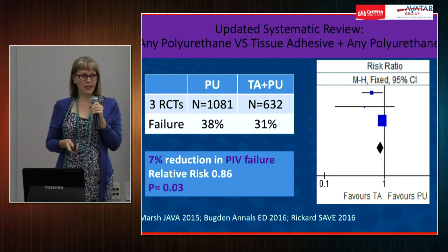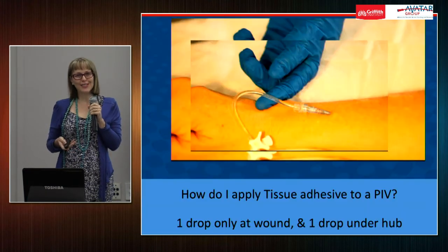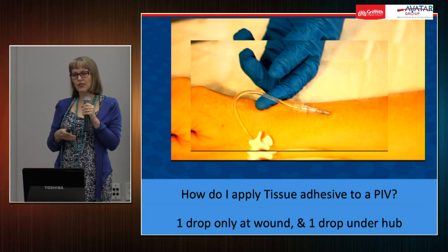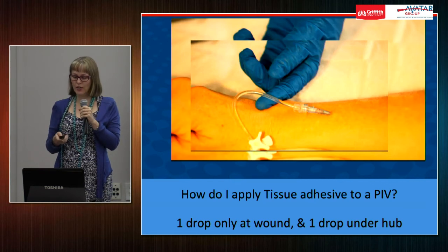But if you have an IV team, for example, where you can control who's using it, then we do recommend that. So obviously that's not for a patient that's having a procedure, but for patients that are going to need their IV in for a few days, that you maybe at high risk, you don't want to lose the line, then we would recommend it.